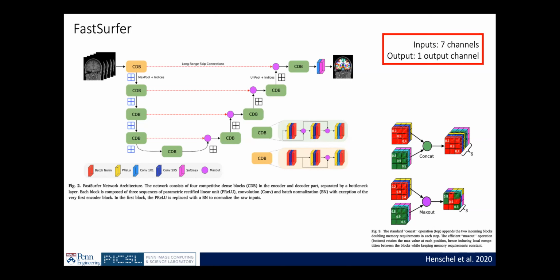Over here, the difference is that they take the 2 features, one coming from here and one coming from here, and just do a max operation. So whichever feature for that particular voxel has a higher value, they take that into account. This is what I'm trying to explain. In U-Net, you have, let's say, a 3x3x3 cube coming from here, and a 3x3x3 cube coming from here.